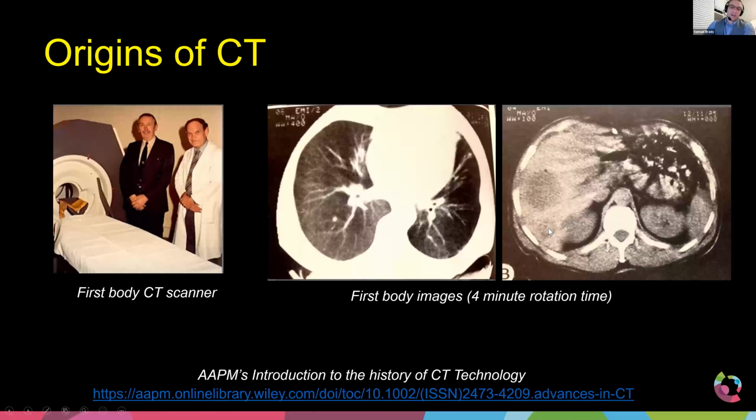So anyway, I just wanted to give you some pictures and some actual data, because we did physically talk about it, but we just didn't actually have any data to show you. So now switching back to the topic for today, which is body CT. So we're going to talk the trunk, chest, abdomen, pelvis.